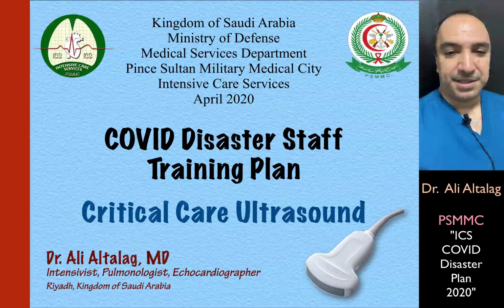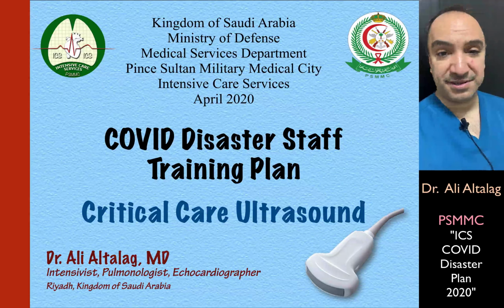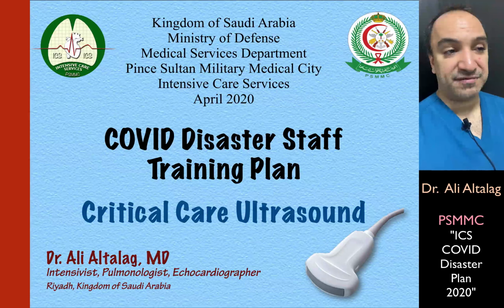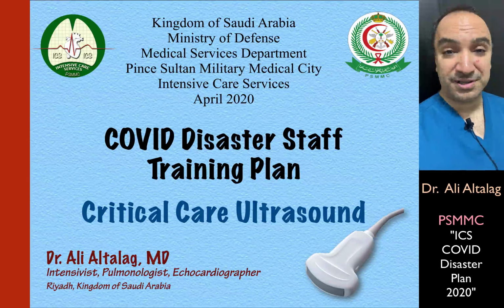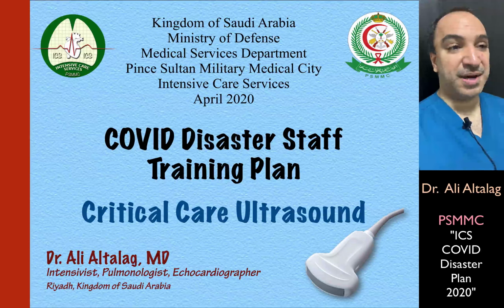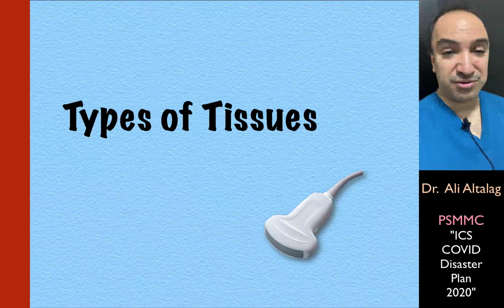Okay, good morning, everybody. I'm going to talk to you about a very useful topic in case of COVID disaster. This is, first of all, one of the COVID disaster staff training series. I'll talk about critical care ultrasonography, and I'll try to be brief, up to the point. The reason for this presentation is just to prepare our joining staff for any unwanted disaster caused by COVID. So without further ado, I'll just go right into it.